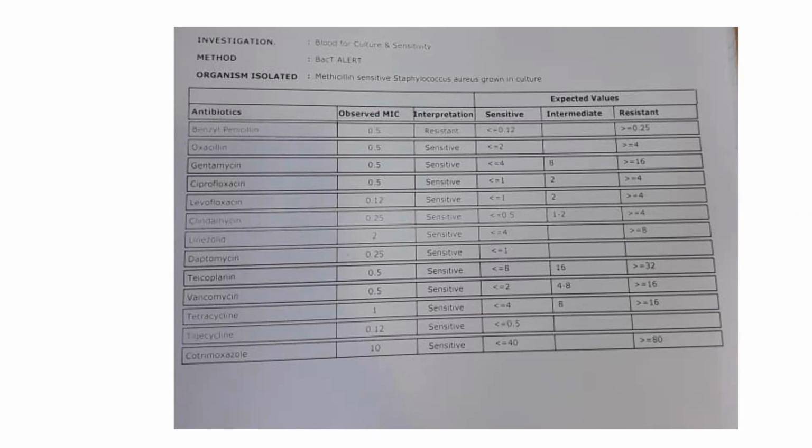So, sir, when you mentioned about this Bacti alert or BacT/ALERT where the bottles are put in an incubator, what happens to the solid growth media? Are they also put in the same incubator with the same signal that comes in, or is there a different way of processing that? Yes, a different incubator, and then they just check the culture media at standard intervals. Let's say they have timings for that, so they keep checking the plates whether there is a growth of colonies. They streak it in a standard manner, and every few hours they check, and if there is a colony growth, then they process it further. So there is an incubator, but there is no automated alert. So that is a manual way of keep seeing the plates.